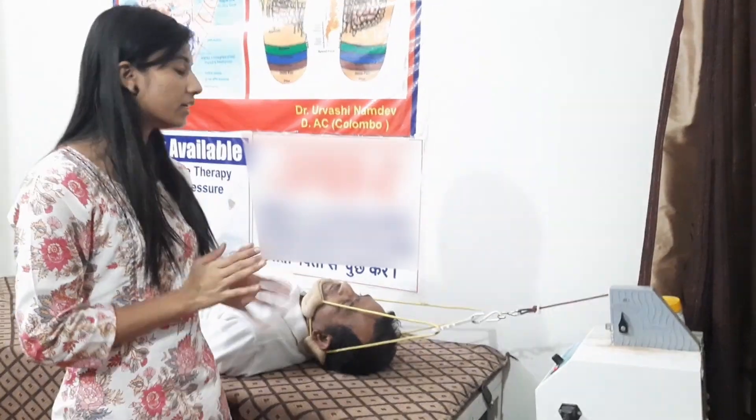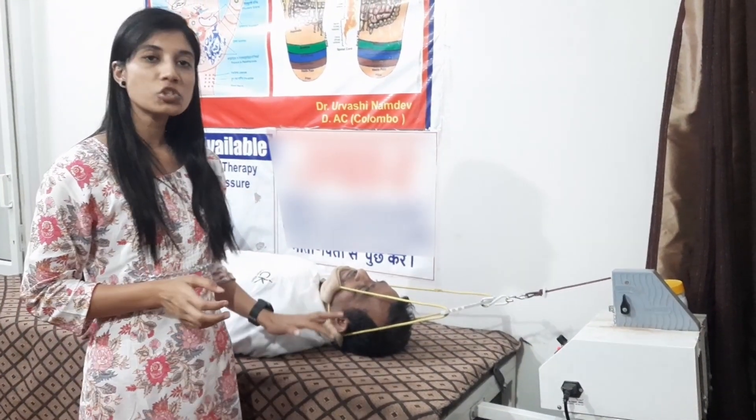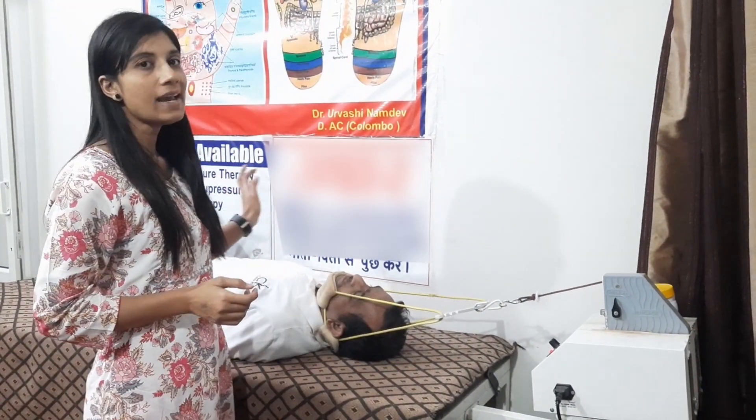First, things to remember: if the patient has any jewelry or ornaments, we have to remove them from the neck and ears. Second, placement of the patient — the position will be supine. The knee can be flexed if the patient has back pain.